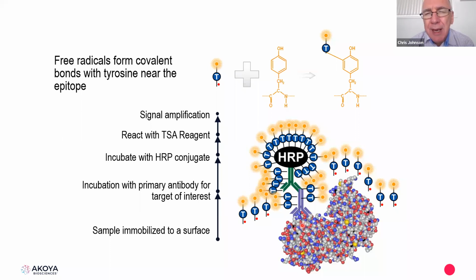Over that time, it's become more acidic. Therefore, the pH will change, and the pH change will cause the dye spectral position to shift. And therefore, it's not going to be perfectly the same as the proposed spectral position.